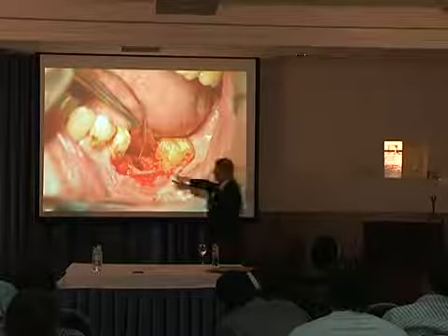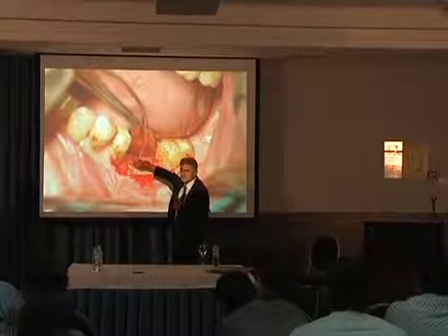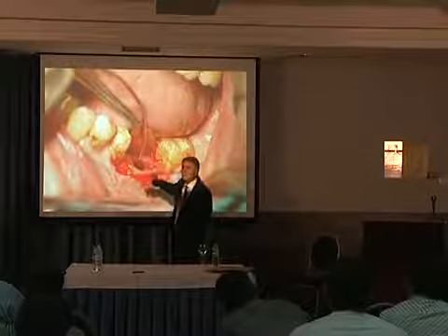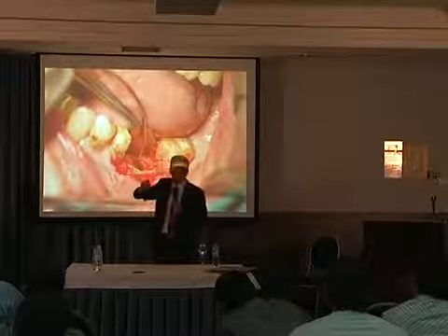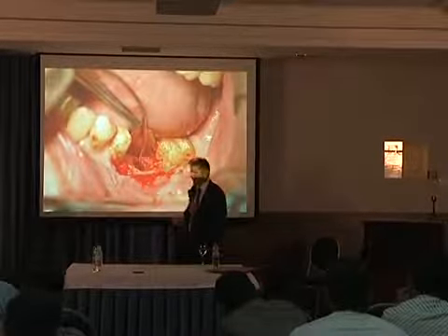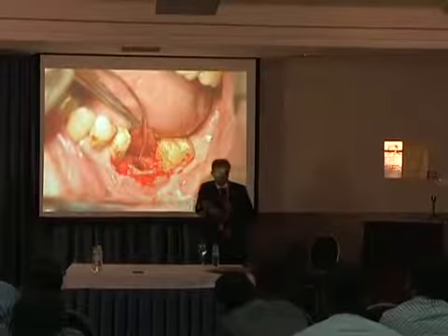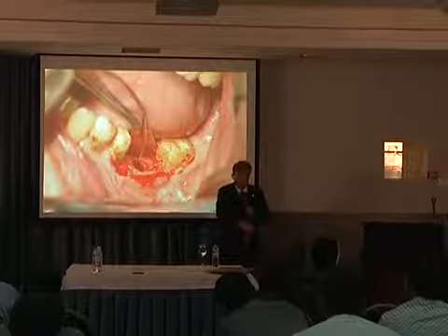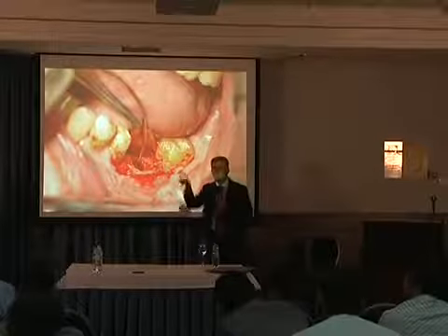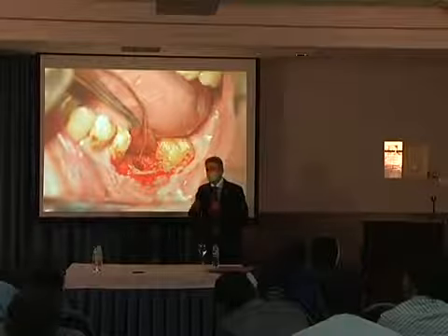What is that? What do you think it is? This is the most important intraoperative navigation instrument. You can go inside and touch. Is there a connection to the mental nerve? With this instrument you can go in and try to feel whether you touch the mental nerve or not.